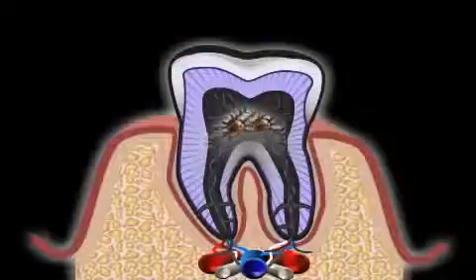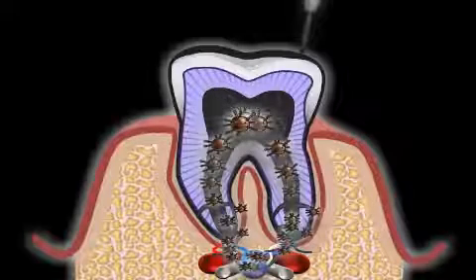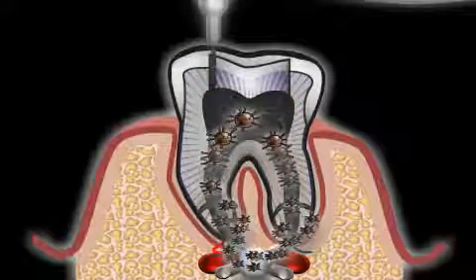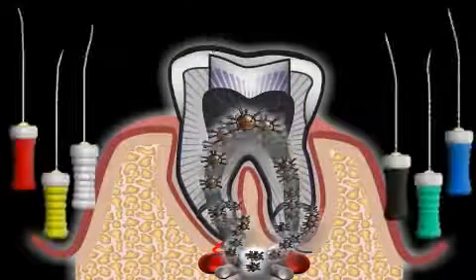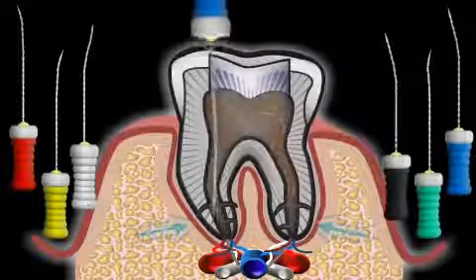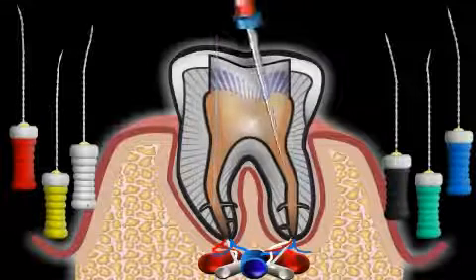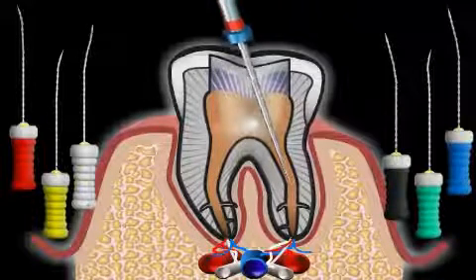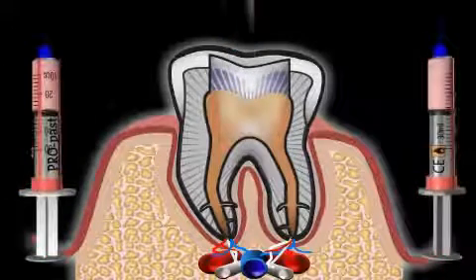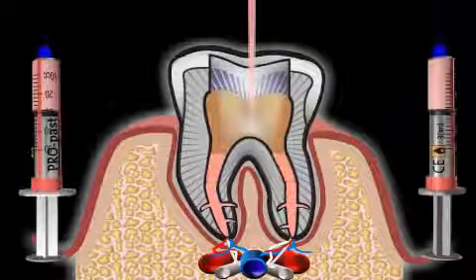The objective of a root canal treatment is to completely remove the destroyed tissue, which may also be infected with bacteria in some cases, from the interior of the tooth, so that the infection is prevented from spreading to the bone. The tooth is connected to the bone through numerous small canals at the end of the root. Since a complete cleaning of the interior of the tooth is never 100% successful, the dentist attempts to close the pulp cavity tightly with a special compound, so that any remaining bacteria inside don't have space to multiply.